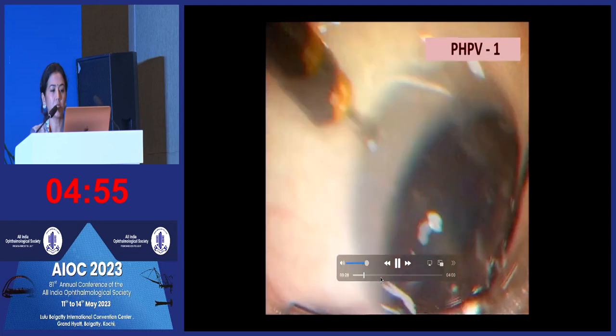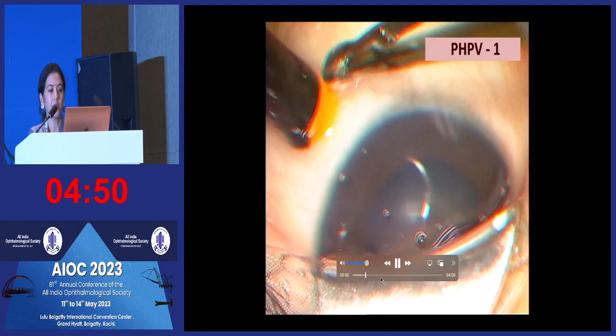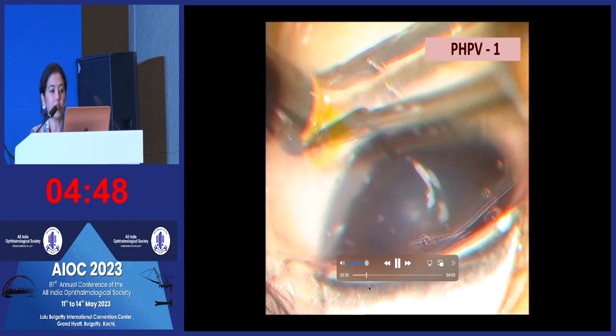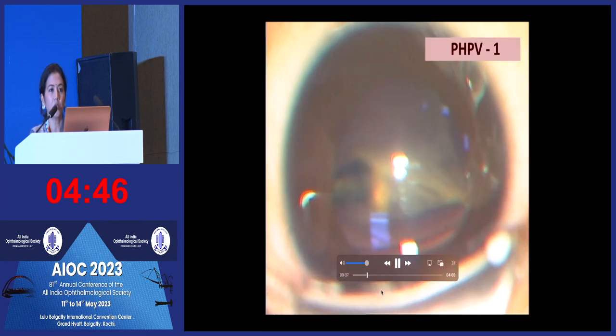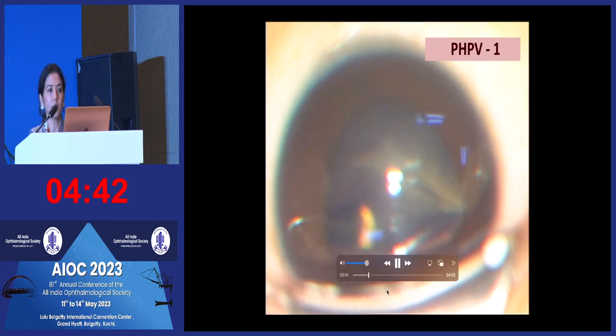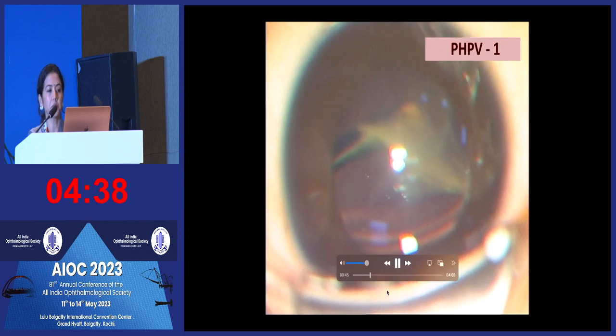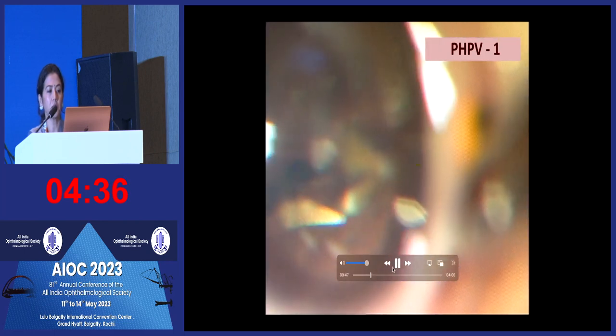So what we did in these cases was a 23 gauge vitrectomy, and basically we did a lens sparing vitrectomy. Of course, an IOL calculation is always done for these children in case there's some lens touch and you may need to convert it into irrigation aspiration and put in a lens.